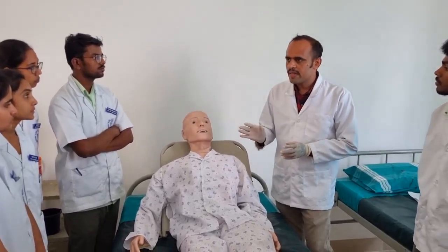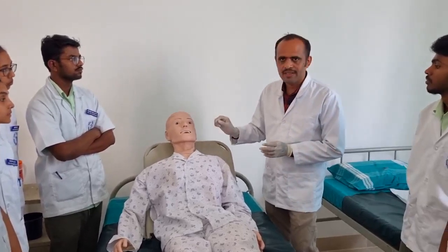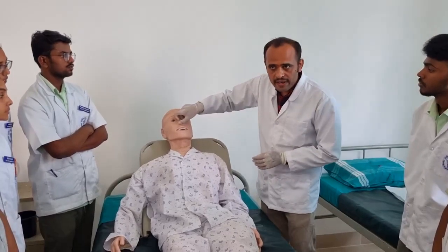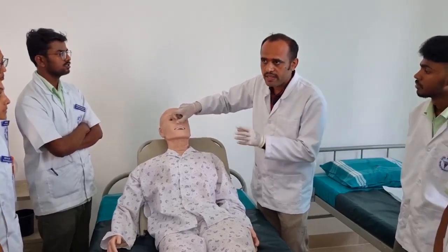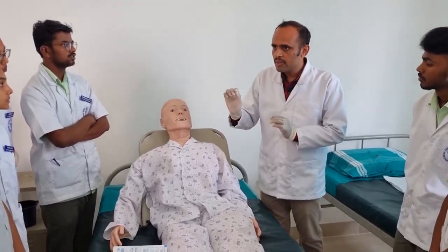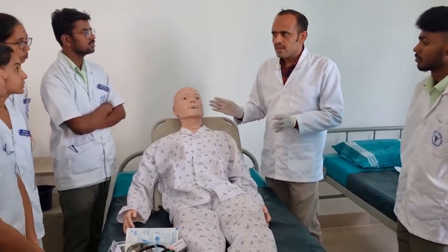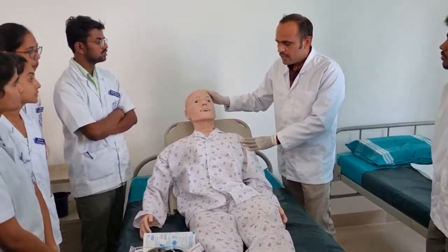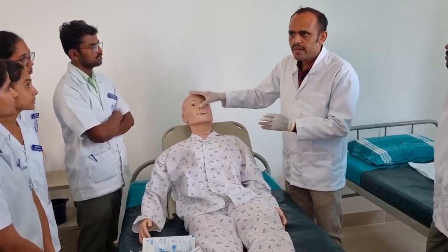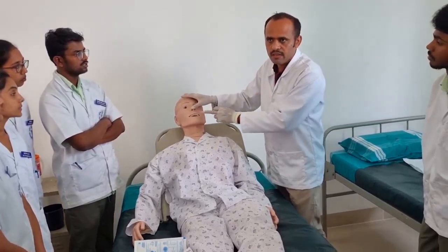We have to keep in mind that before inserting the NG tube into the nostrils, we have to check whether there is any deviated nasal septum or nasal polyp. If there is a nasal polyp and we insert the NG tube, there may be chances of bleeding.